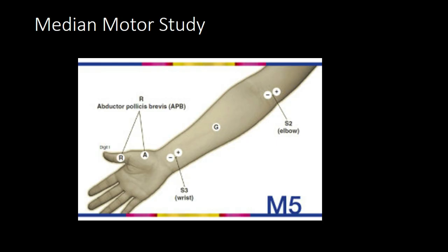So when we stimulate mid-wrist between the flexor pollicis, flexor carpi radialis and palmaris longus tendon, 7 centimeter proximal to the active electrode, the cathode should be facing the recording electrode. When you guys are gonna do it, again, I can tell 100 things, but you will not remember it. More importantly, if you remember the landmark, that's the best piece. Also, we do have the handouts you can always get when you come on rotation on the very first day or a day or two earlier, so you get yourself prepped when you come in the lab.